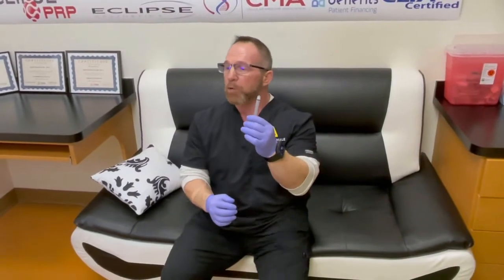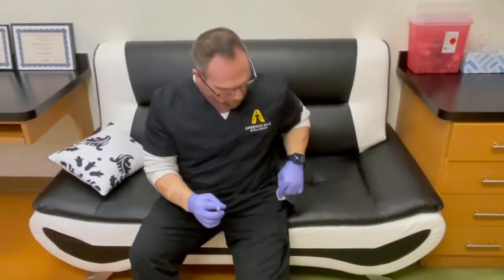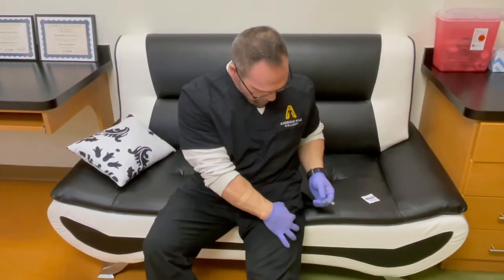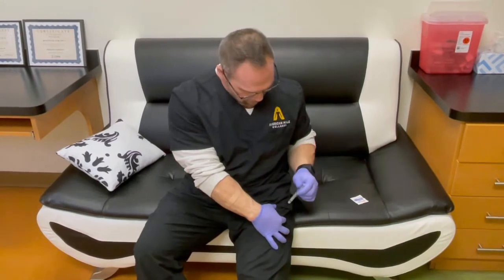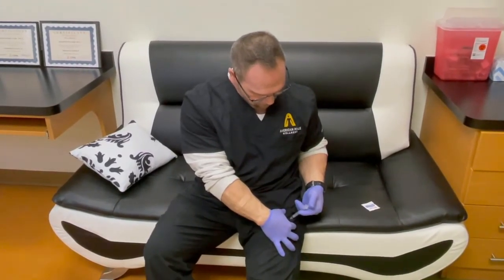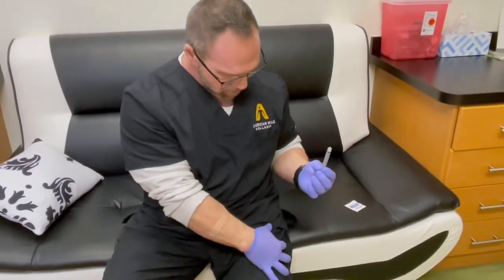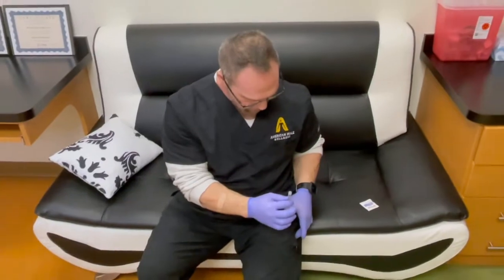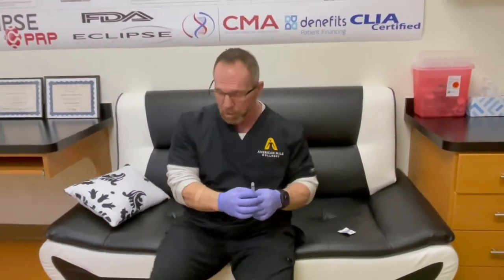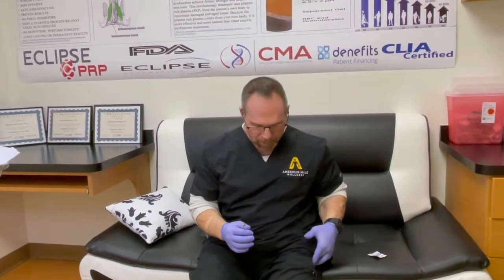Once your needle is loaded, take an alcohol pad and clean that area thoroughly. Then pinch the skin in that upper outer quadrant, plunge the needle through the skin, and slowly push the volume in. Remove the syringe. If there's any blood, clean again with alcohol and use a band-aid if needed. You can inject in either leg — just use the upper outer quadrant on each side.